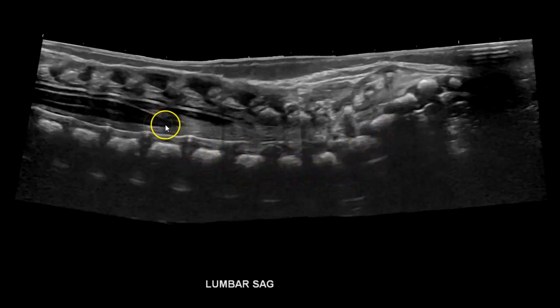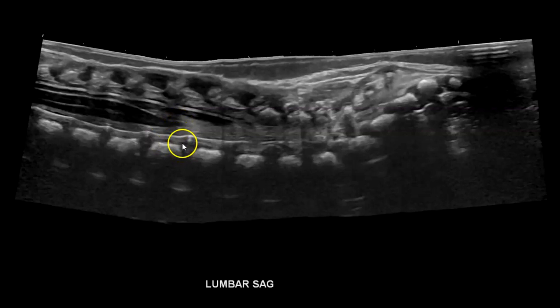Counting 5, 4, 3, 2, 1 from the sacrum — the conus medullaris ends at the end of L1, which is normal. Here you can see the central canal of the spinal cord. With labeling: sacral, lumbar, and this is T12 — thoracic vertebra 12.